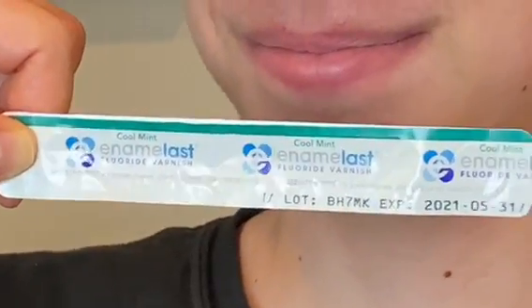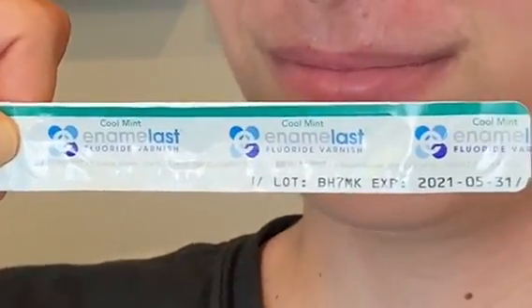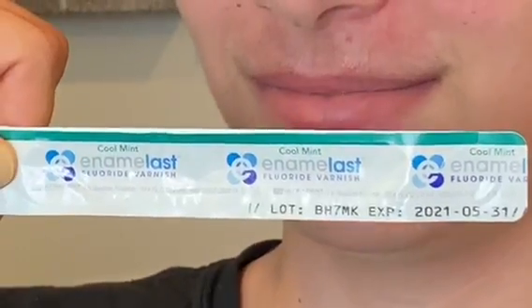Hi everyone. Today we're gonna learn how to put fluoride varnish on a child with braces.